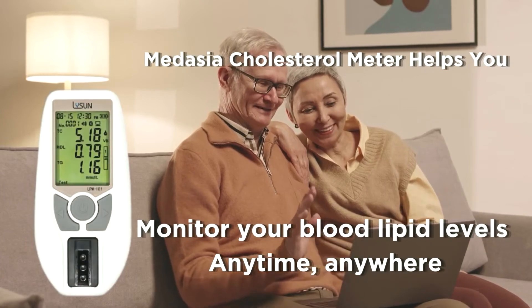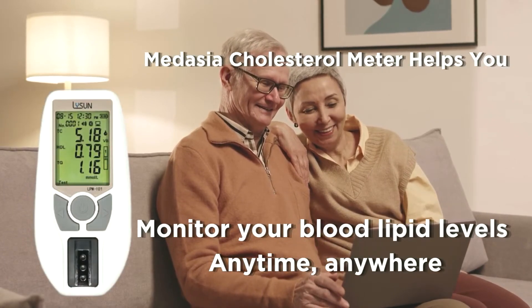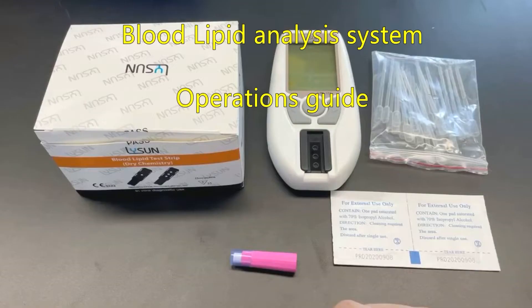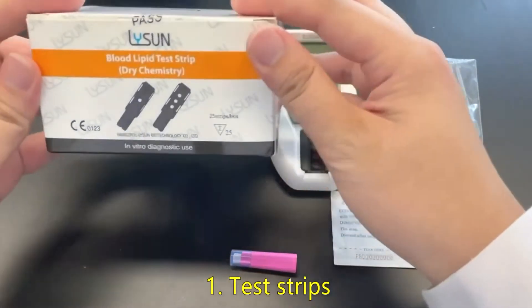Medasia cholesterol meter helps you monitor your blood lipid levels anytime, anywhere. Boot Lipid Analysis System operations guide. Test preparation: one, test strips.